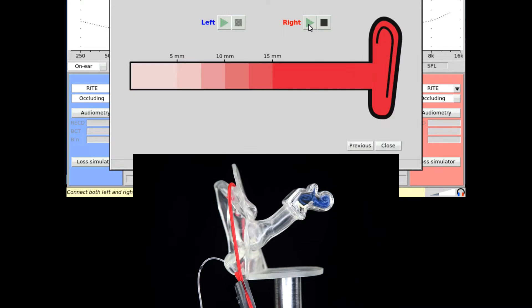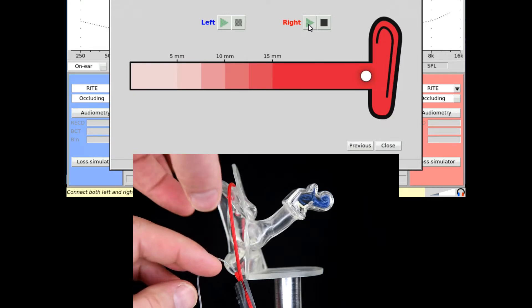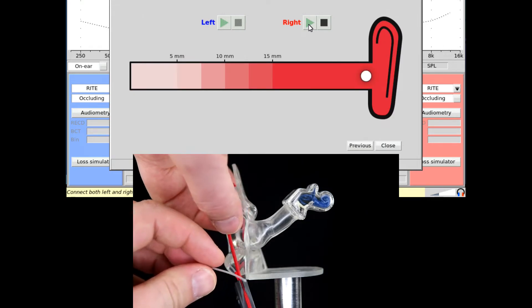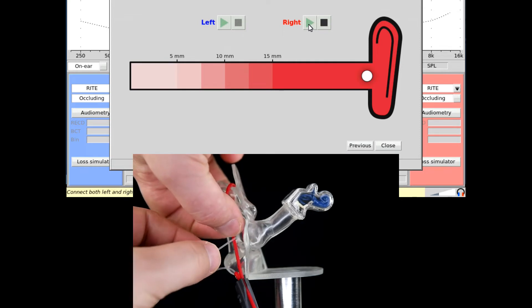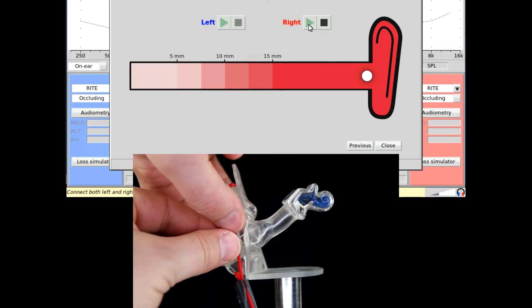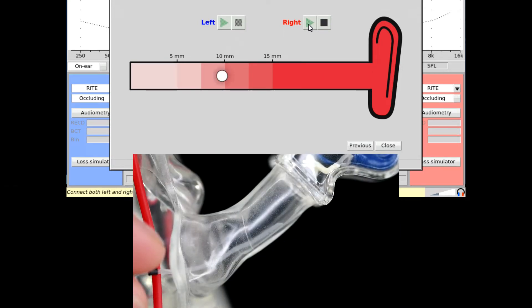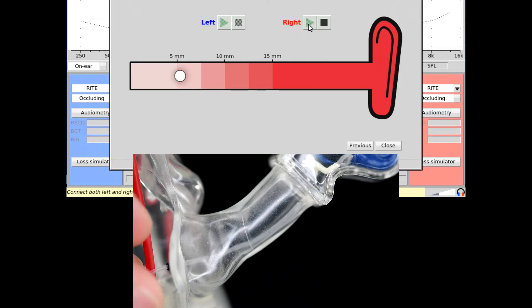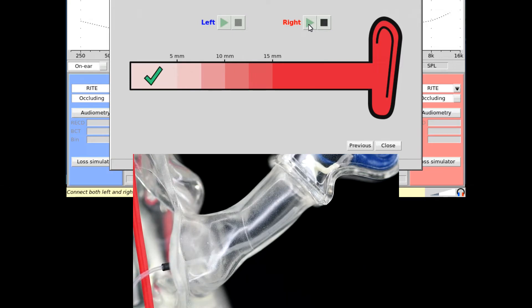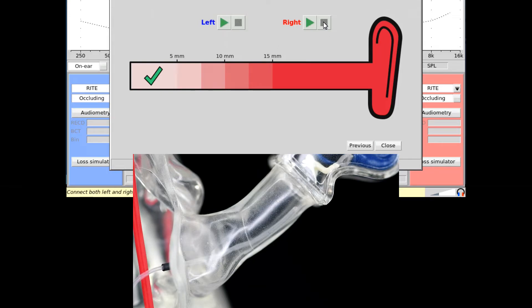Start with the probe tube outside the ear, then slowly move it into the ear canal. The white ball indicates the progress in real time. Once the appropriate position is reached, a green check mark appears accompanied by an audible chime. Click stop and move on to the next ear.